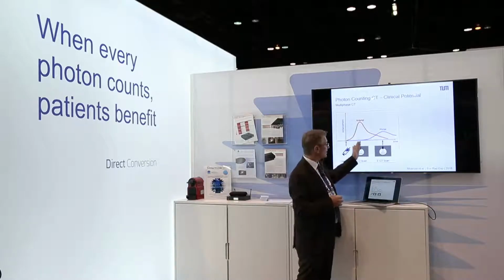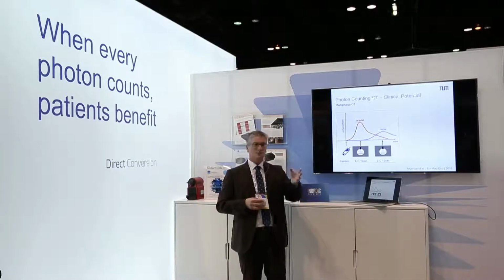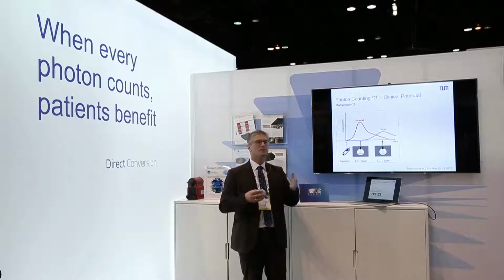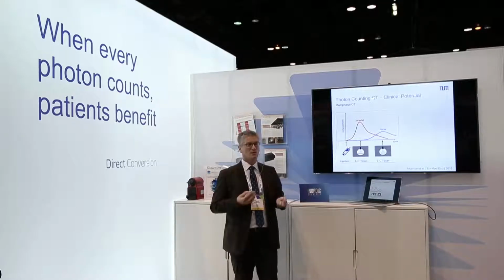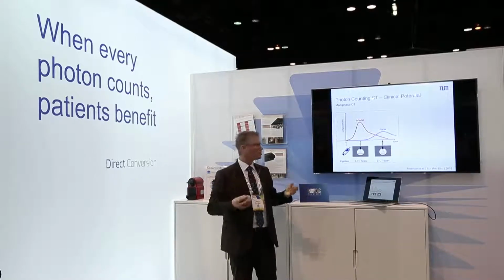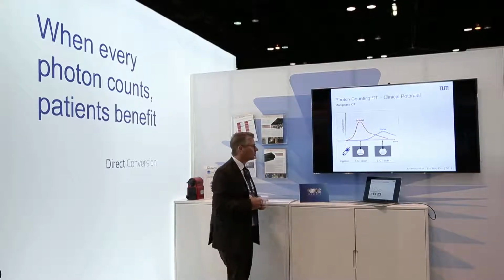And by doing CT scans at different times, you can look at how different lesions take up the contrast agent early or late, and this gives you diagnostic information of whether it's a benign or a malignant lesion. It's used all over the body, and it's very important.